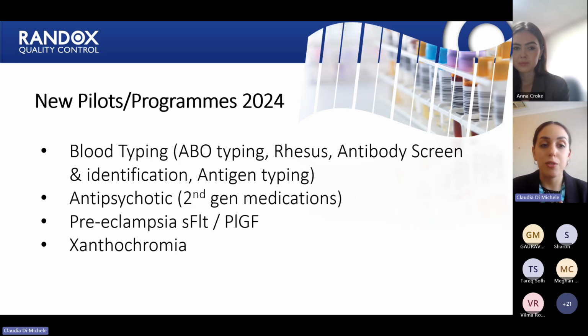So you will receive notifications about each of these pilot programs. If you want to get involved, they are free to be involved in. You get full reports to see what other labs are performing like in these programs. They're usually 2 samples. And then it'll give us an opportunity to amend anything in these programs before we release them as a full program, likely in 2025.